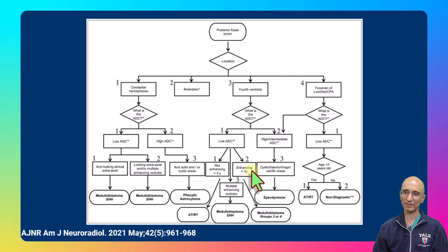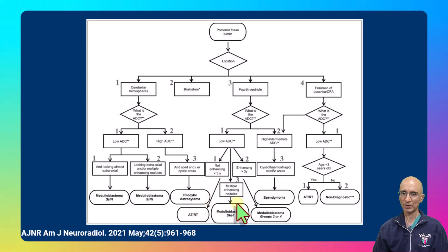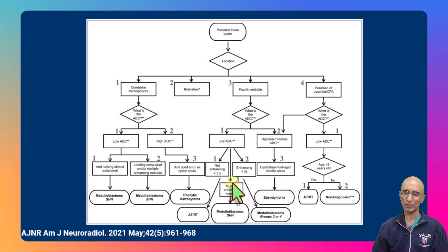We are dealing with a mass likely arising from the fourth ventricle. The lesion demonstrates low ADC signal and the child is less than three years old. So the most likely diagnosis is ATRT. Another possibility could be medulloblastoma, particularly the sonic hedgehog type. But based on the patient's age, I would strongly favor ATRT.